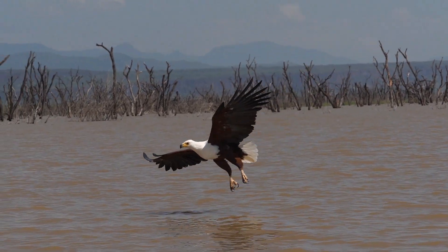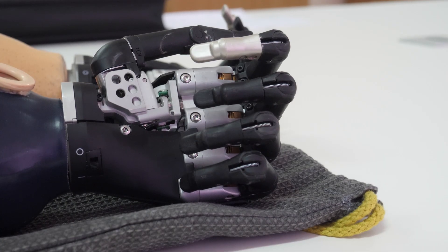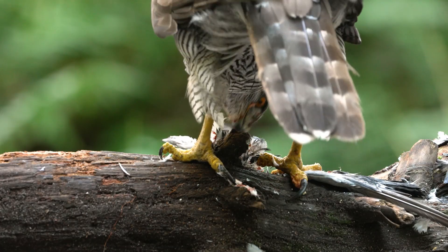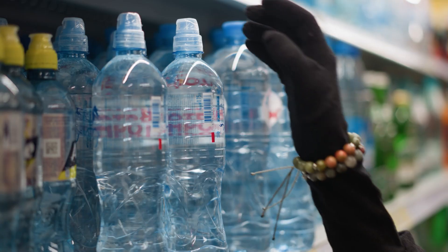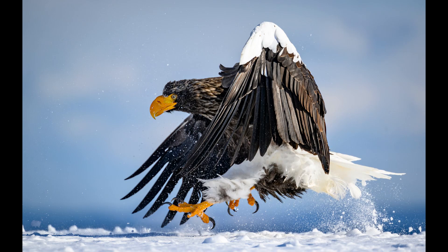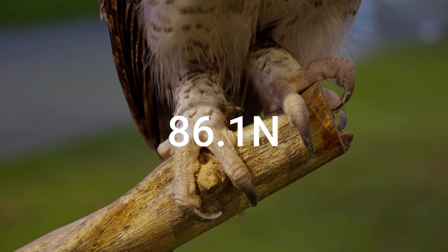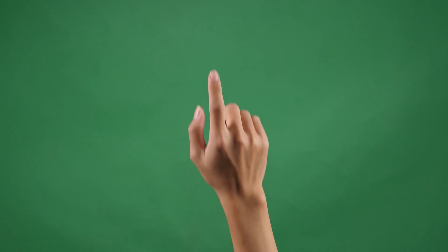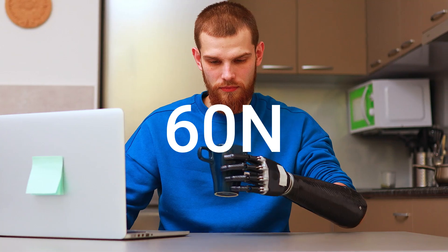The bird-inspired claw designs didn't just hold their own. In some cases, they were actually better than the traditional five-fingered prosthetic hand. Take the anisodactyl claw, for example. It's modeled after a hawk's foot and was crazy good at gripping cylindrical objects like cups or bottles, thanks to its unique toe setup that gives it extra stability. This claw could handle up to 86.1 newtons of force — that's like holding onto a gallon of milk with just one finger and not letting go. It's also way stronger than the minimum requirement of 60 newtons for prosthetic devices.